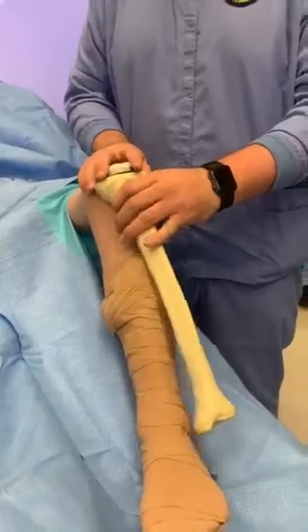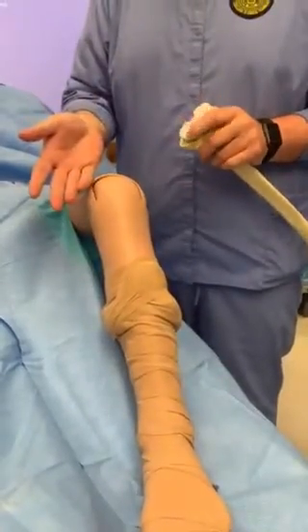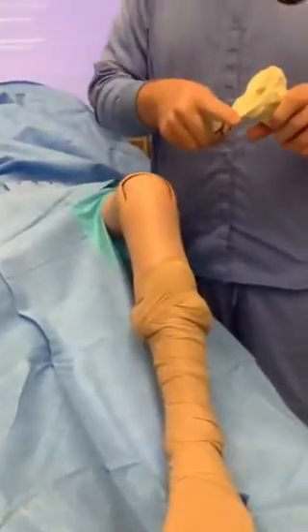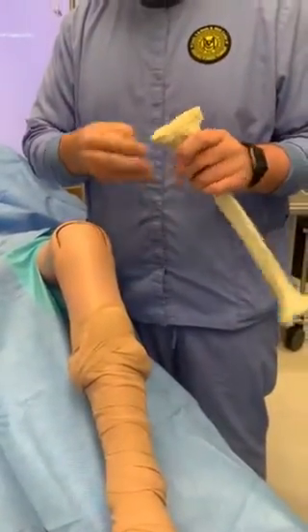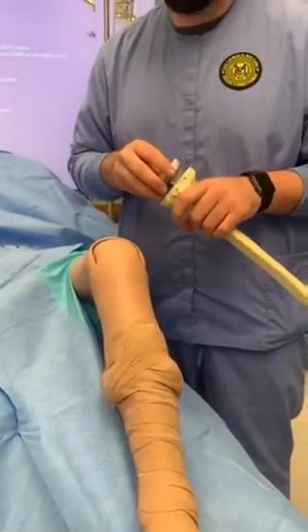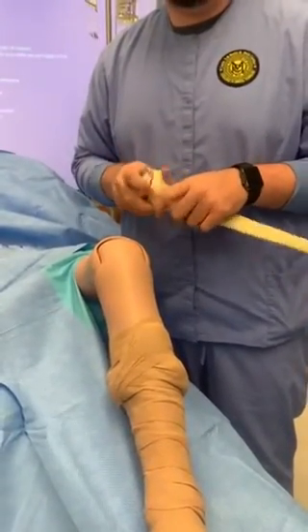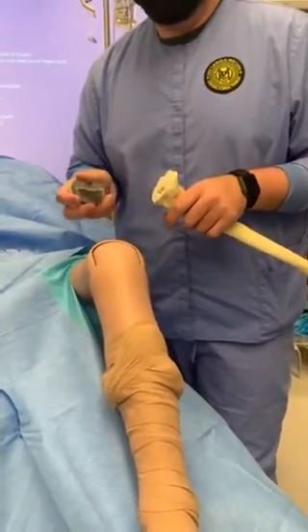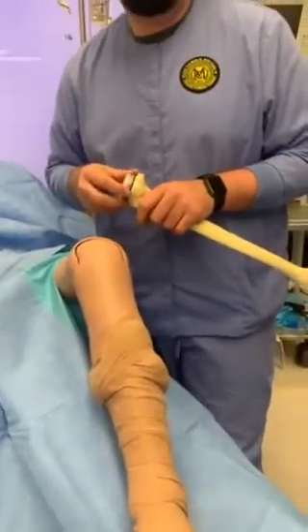Then they flip the patella over and shave that off in kind of the same way — a straight cut that makes the back of it flat. They'll once again determine the right size implant for the patella, and then they cement everything in. Once they cement it in, you're good to go.